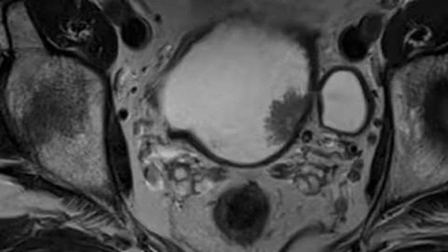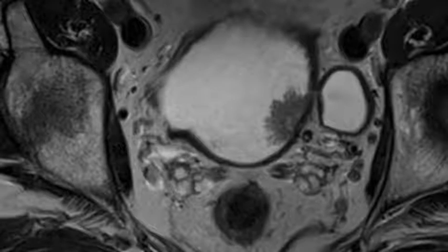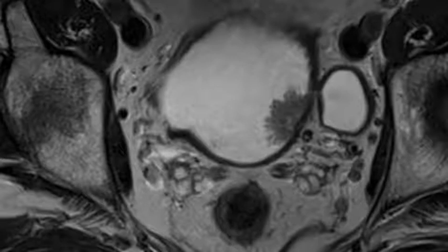Artifact from bowel peristalsis, which can propagate from the abdomen into the pelvis, can be minimized by administering an intramuscular antiperistaltic agent and using anterior saturation bands. Motion correction on the imagers can reduce motion artifact in the area of interest by swapping phase and frequency.